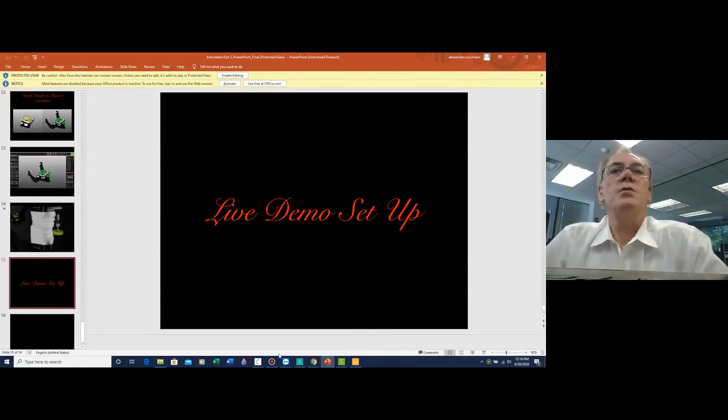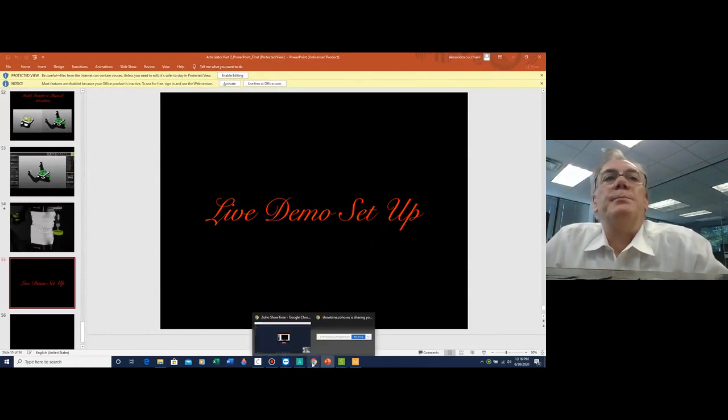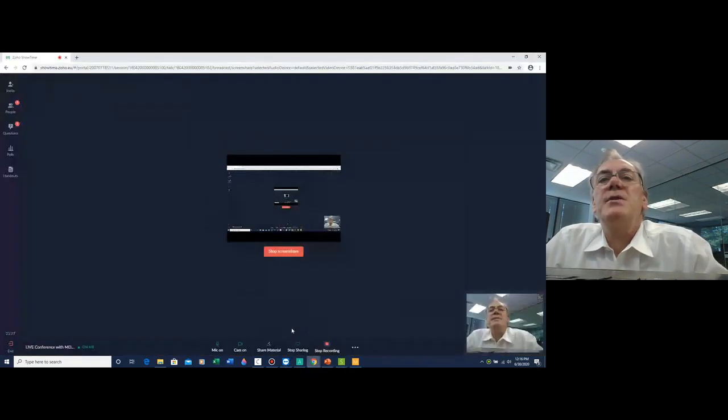We are now going to move forward and try and put all these things together in a sort of live demonstration, but it's going to start just after the video.